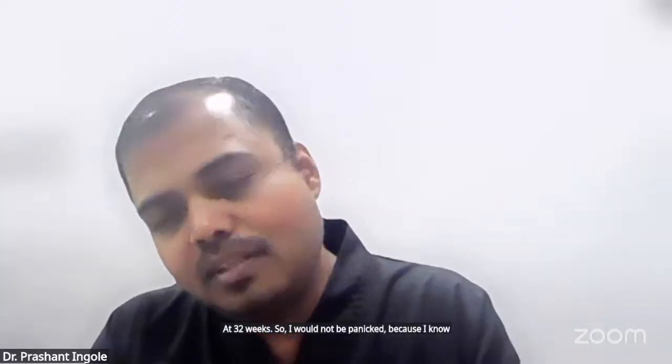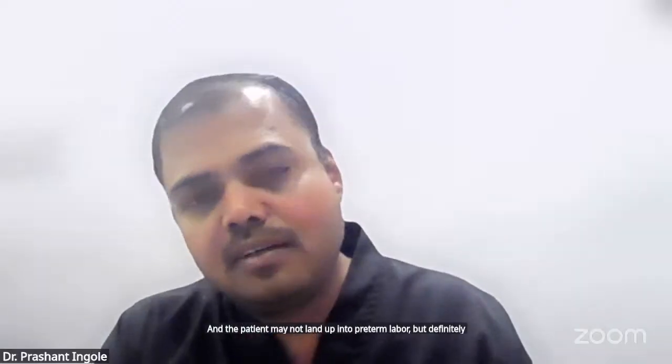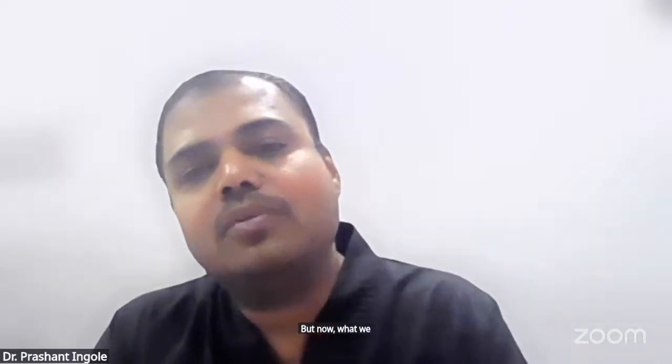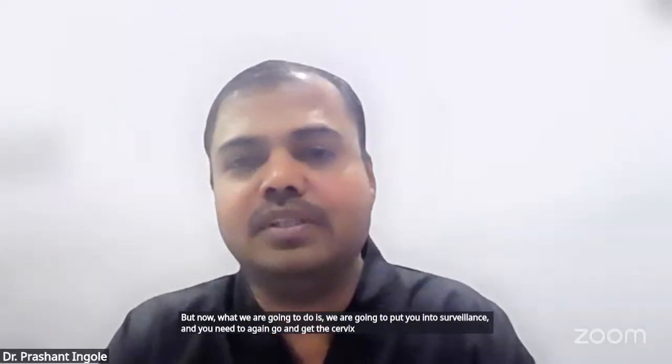I would not panic because I know that the patient is anyway going to progress and may not land up in preterm labor. But definitely, I would tell the patient that your cervical length at this gestational age is 2 centimeters, sorry, and that we are going to put you under surveillance, and you need to get the cervix assessed again at 34 weeks.